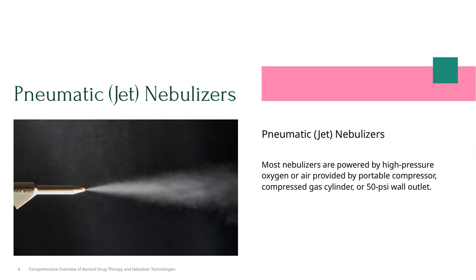Many of these devices rely on high-pressure oxygen or compressed air to generate the aerosol. This supply can come from different sources, such as a portable compressor, a compressed gas cylinder, or even a standard wall outlet providing 50 psi. This flexibility allows for various clinical settings and patient needs.